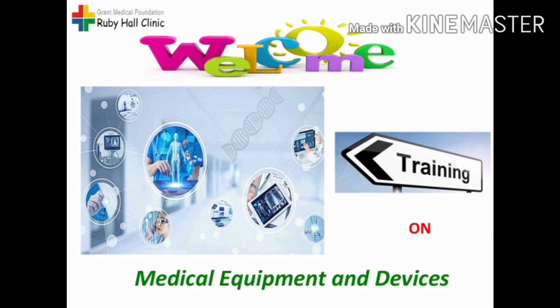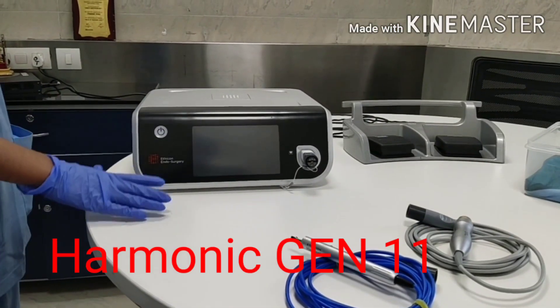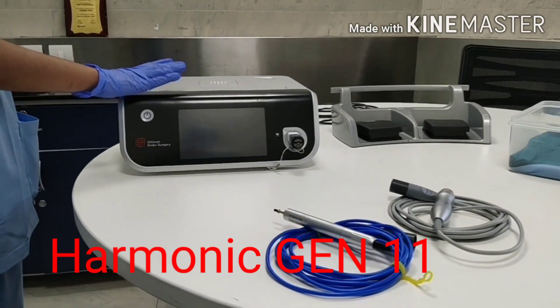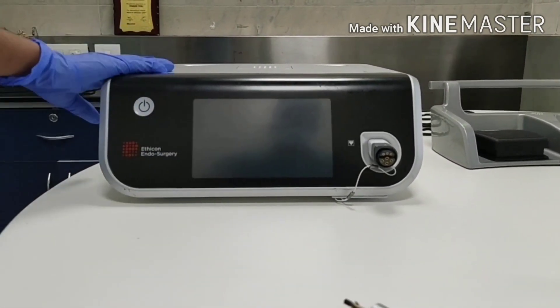Namaste. Welcome to training on Medical Equipments and Devices. Today I am giving operational training of the Harmonic Machine. This is the machine, so starting with the machine.